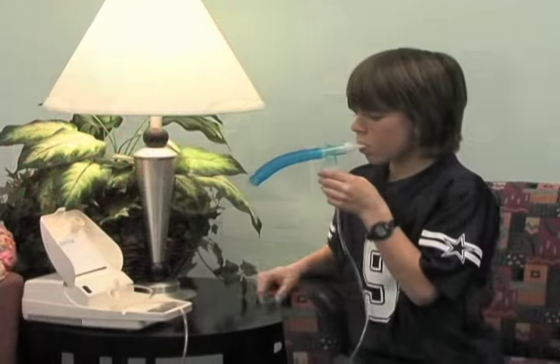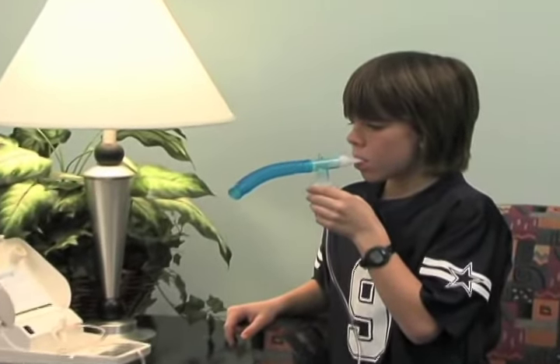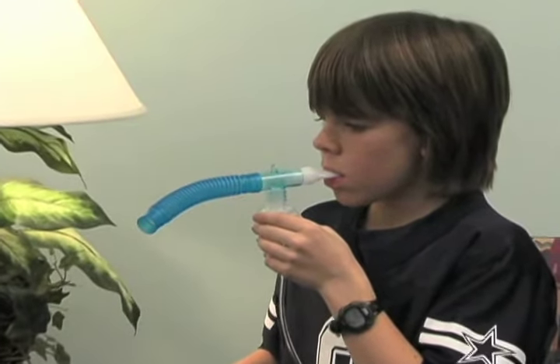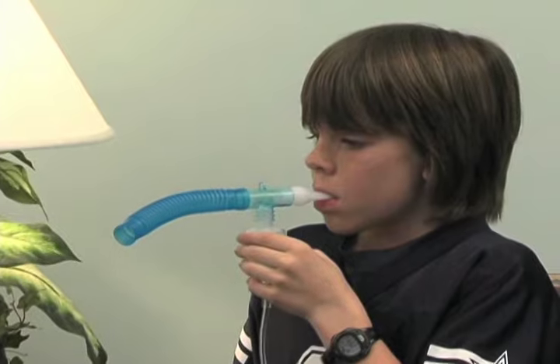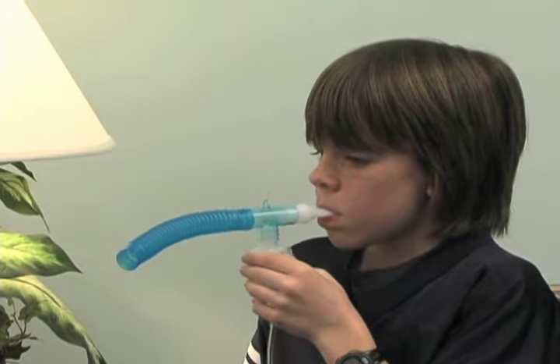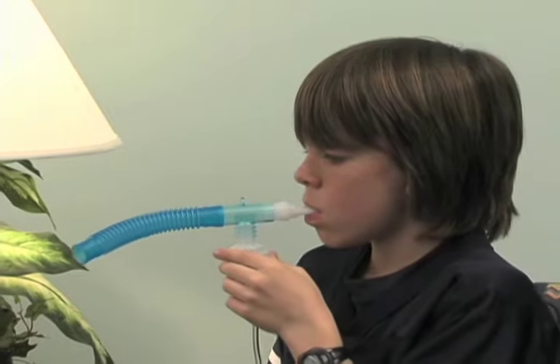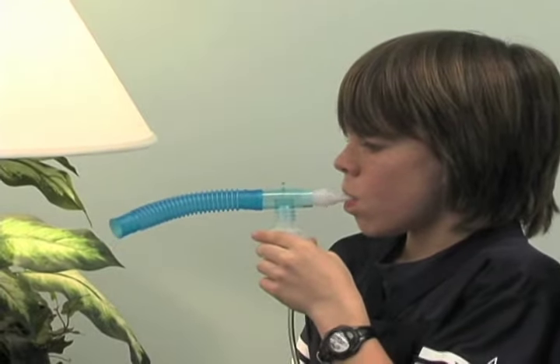When you're ready to give the nebulizer treatment, have your child sit upright in a comfortable chair. It is also important to keep the medicine cup upright so that it does not leak. Keeping it upright makes sure that it works efficiently. Coach your child to take slow breaths through their mouth. The treatment will usually last 10 to 15 minutes depending on the amount of medicine in the cup.